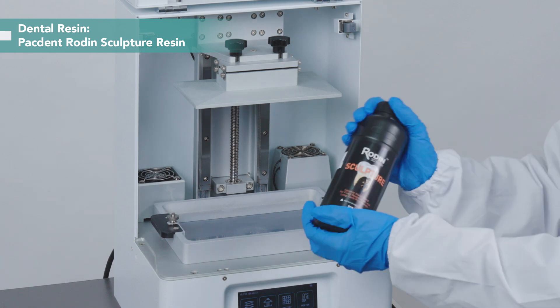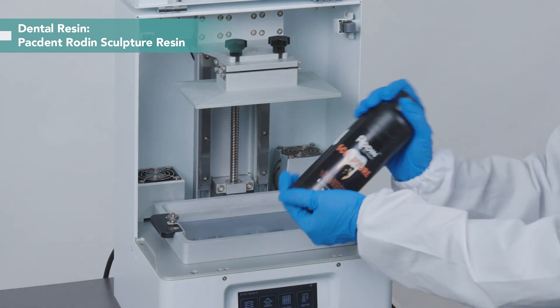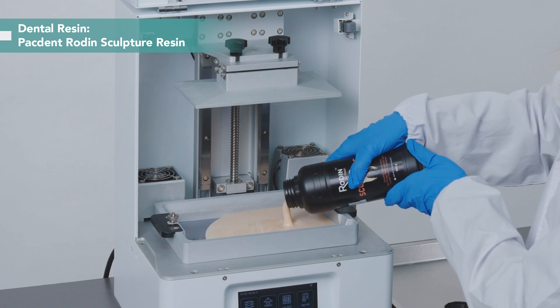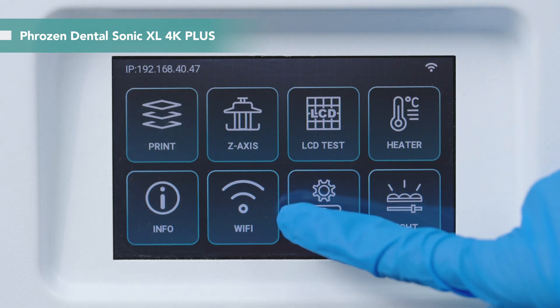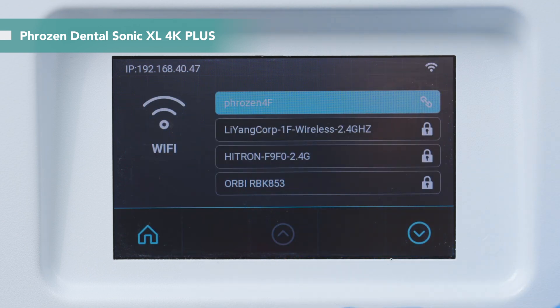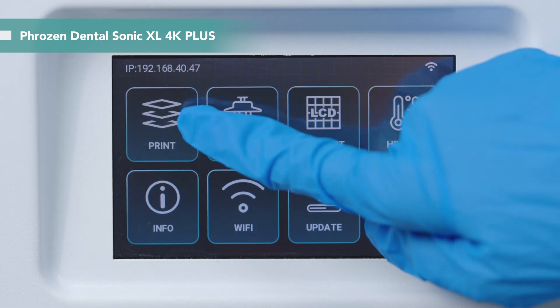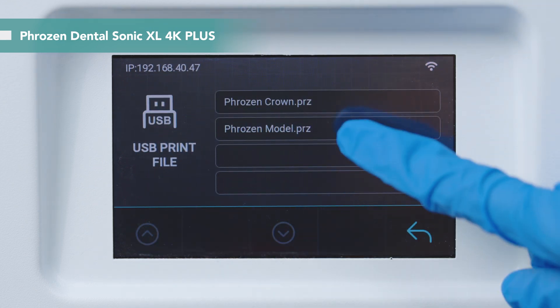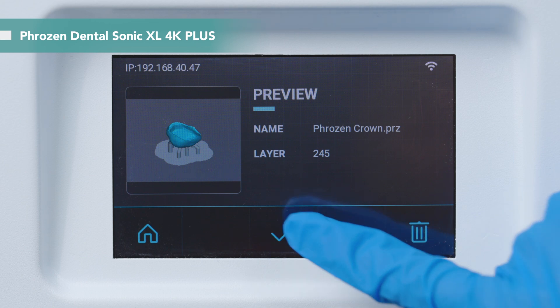Give the resin bottle a good shake before use. For importing the printing files to the printer, you can use USB or Wi-Fi. We use USB to import our files today. Now everything's ready — let's print!